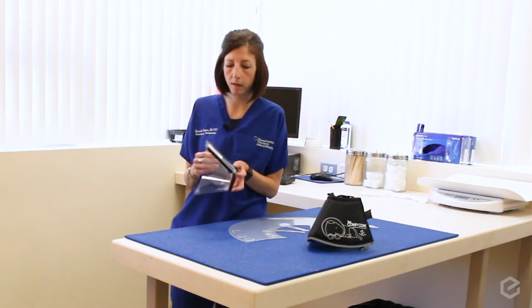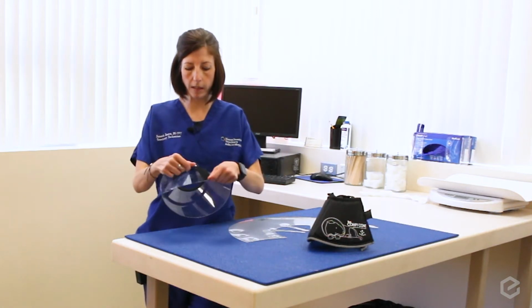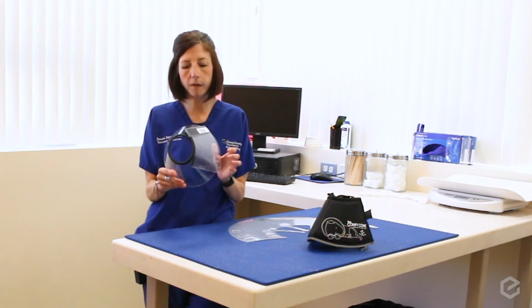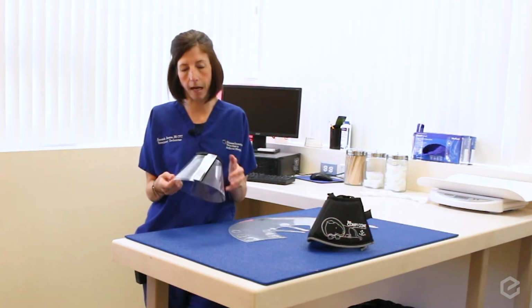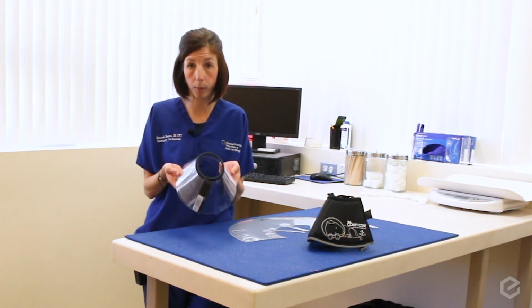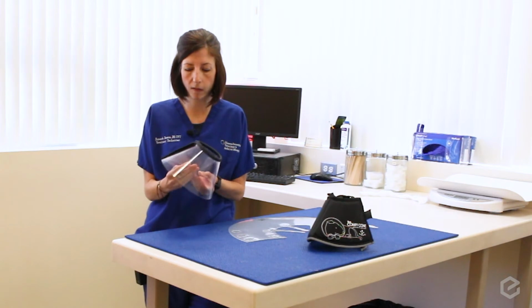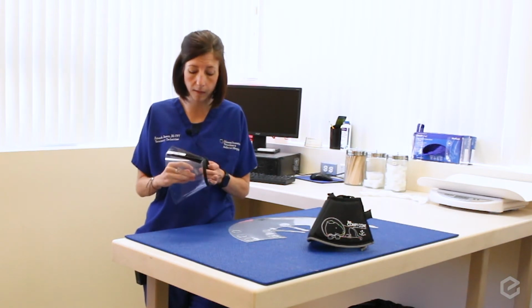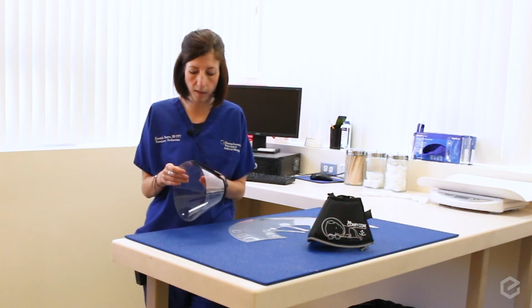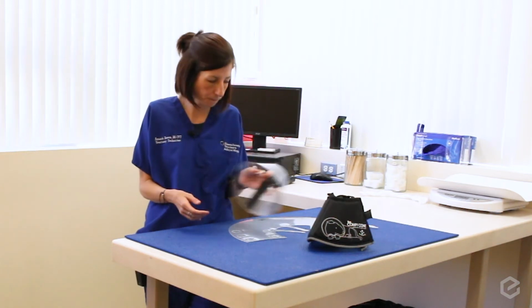They also make these clear ones that velcro, and they're easily slip on and slip off. The problem with these is that they're only one size, so you have to make sure that it fits appropriately to your pet before you buy it. And these are a style that can come off pretty easily, and so it's not one that we typically recommend unless the pet is pretty calm.